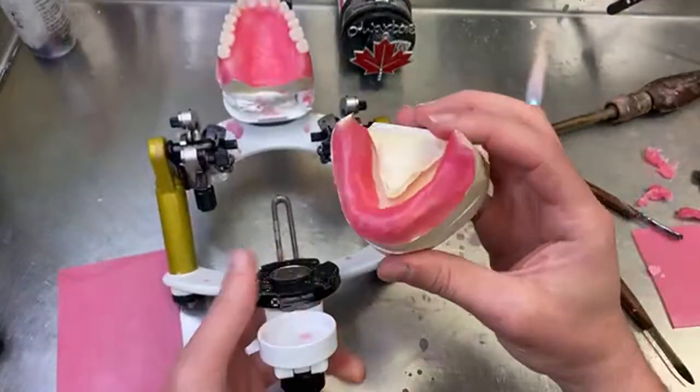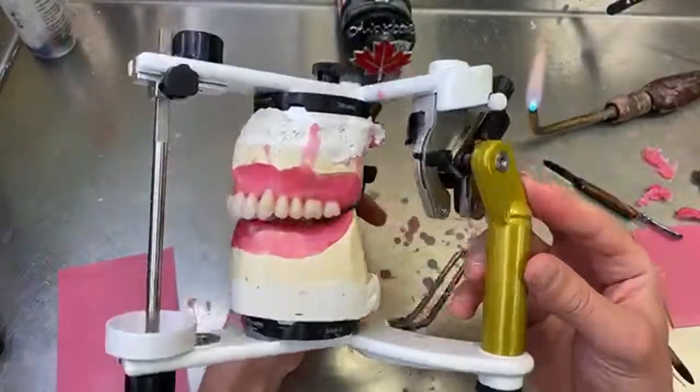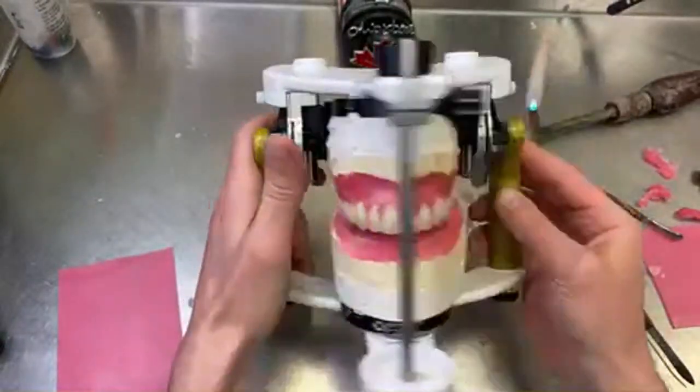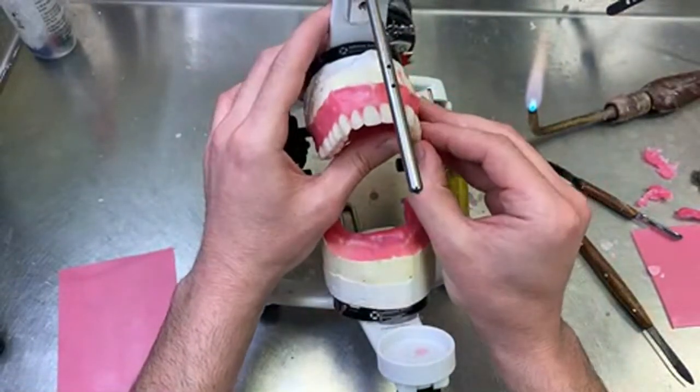So that's a base plate. There you go. I'm gonna see how much space I'm gonna be needing. Probably not much. Maybe that tooth a little crooked.